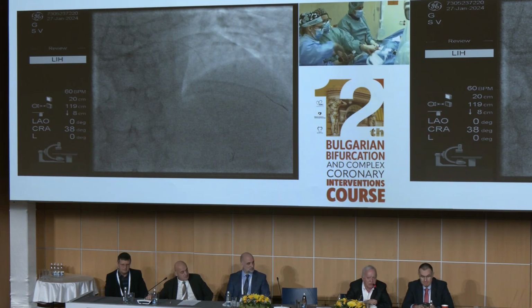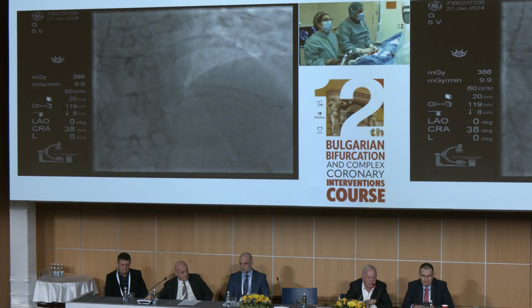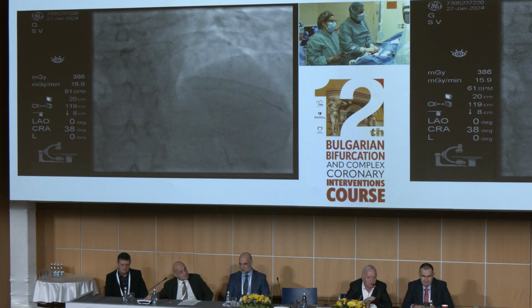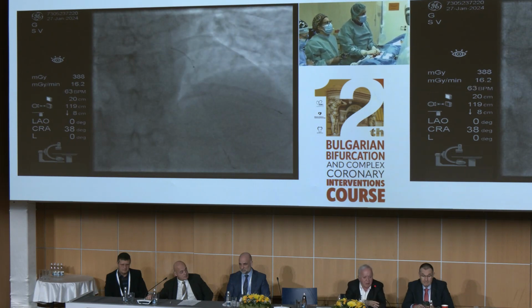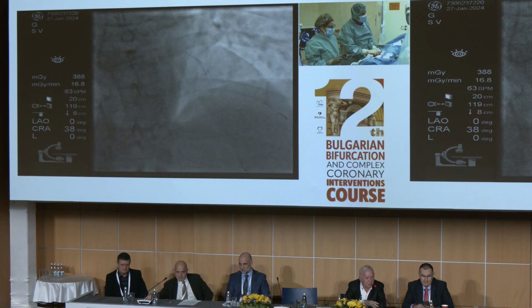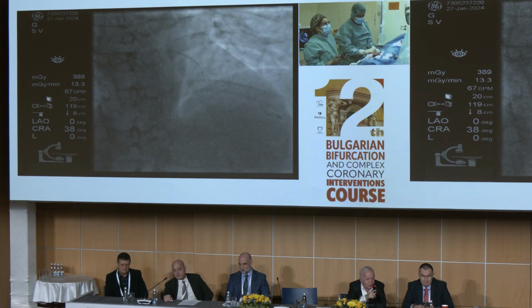What I propose is to do 2 inflations of 30 seconds at 12 atmospheres, consecutive, without moving the balloon. So we feel confident. We are distal to our target. I think the proximal position is important.